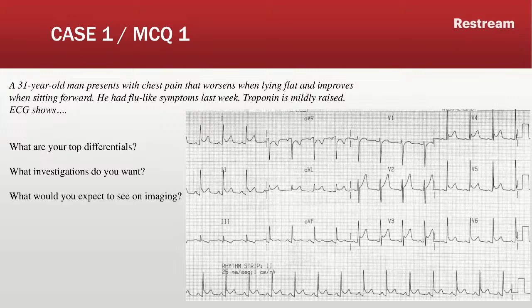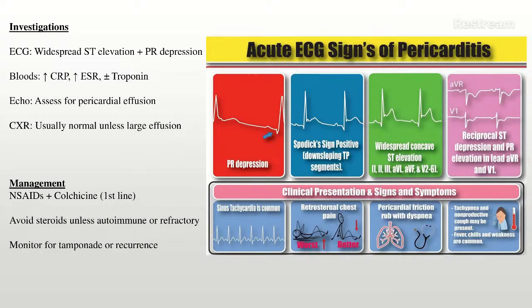Okay. Again, the ST elevation is concave in shape. Okay. Oftentimes they will present with tachycardia and chest pain. So a key feature is chest pain that actually improves when the patient leans forward. Okay, that stops the pericardial rub, the pericardial friction. So when you lean forward, the chest pain tends to improve. Okay. Oftentimes they can also present with symptoms of infection.